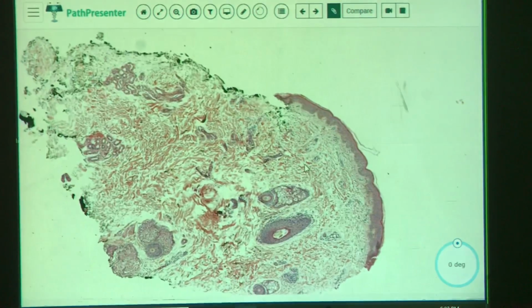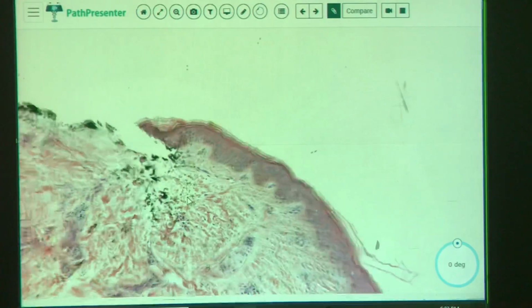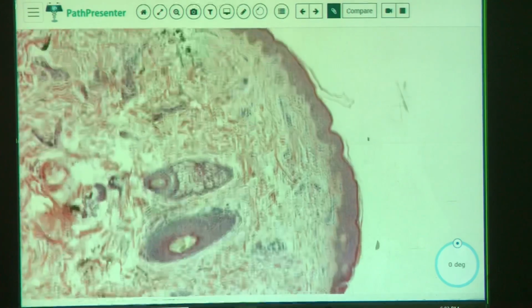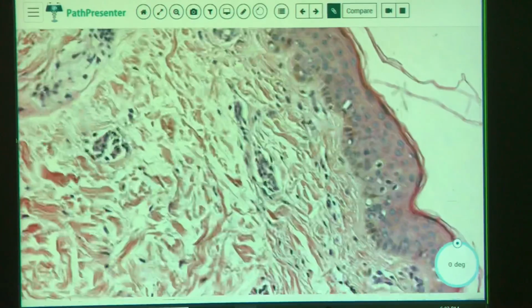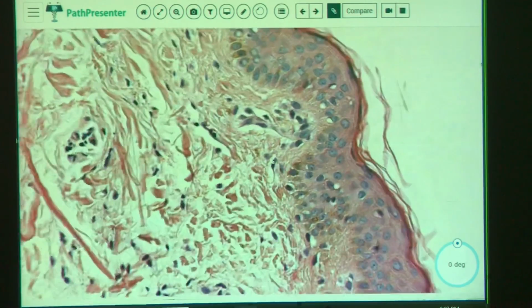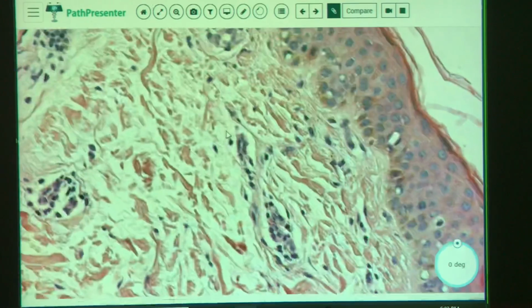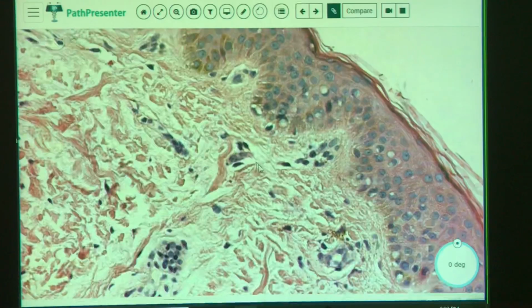Okay, so what do we have? So there's some ink there. The skin, the epidermis looks decently normal. Maybe some solar elastosis. Maybe it looks kind of edematous a little. What you're looking for is very subtle. And it's within the dermis. A few melanocytes here in the basement of the epidermis. There's maybe a melanocyte here.